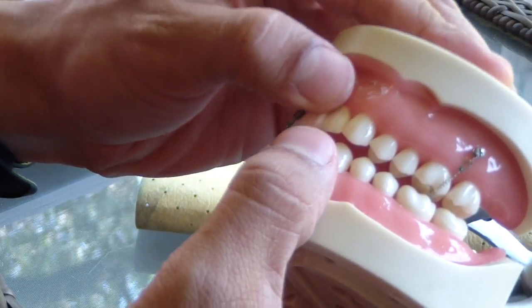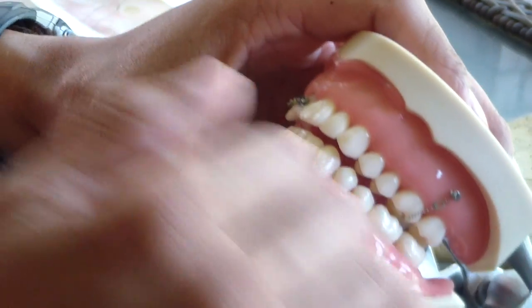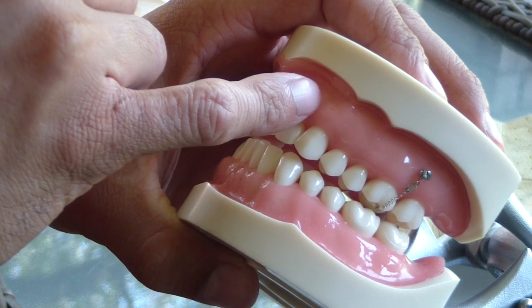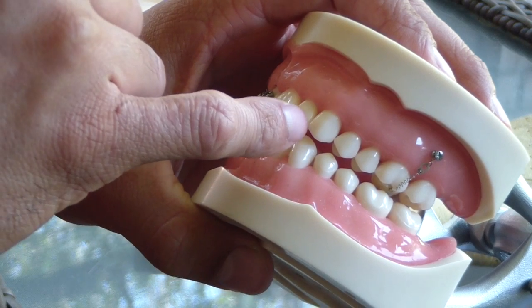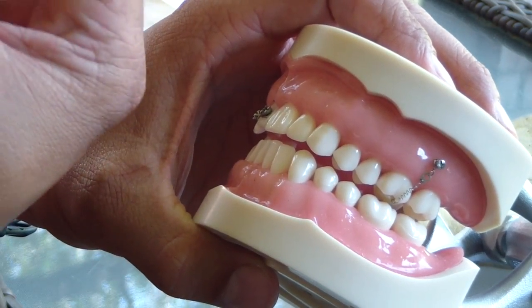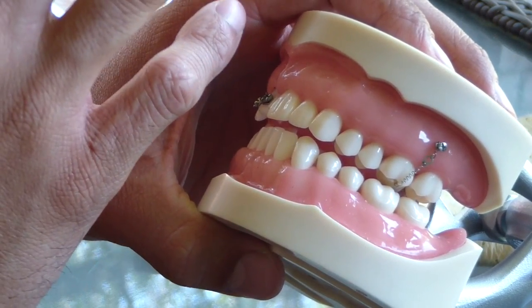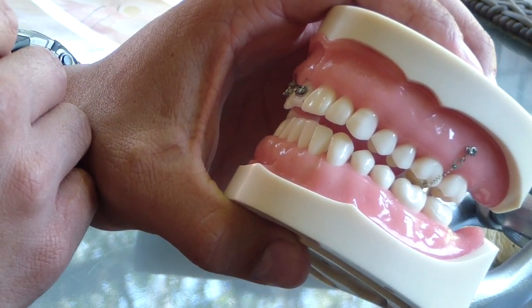This comes into play especially in the aesthetic zone when you have a large recessive defect and you want to do a connective tissue graft alongside a coronally positioned flap. You've placed some vertical releasing incisions and you want to bring the papillas coronally. You use the vertical mattress in the interproximal region in an effort to control the situation, re-approximate those papillas, and fixate them in the position you want — hoping that they will heal that way. So that's it. Cheers.